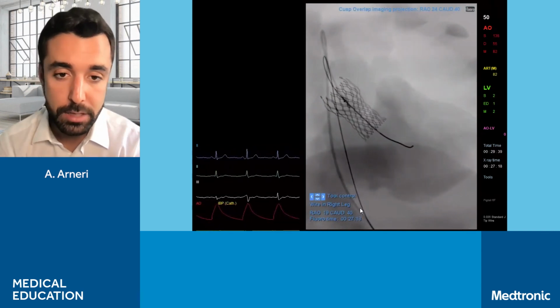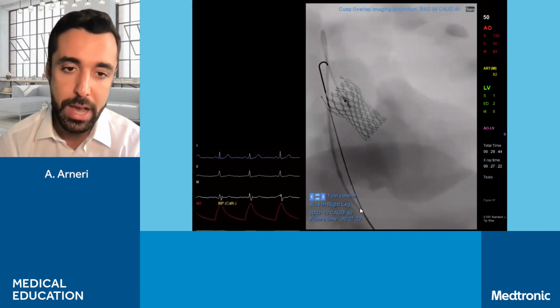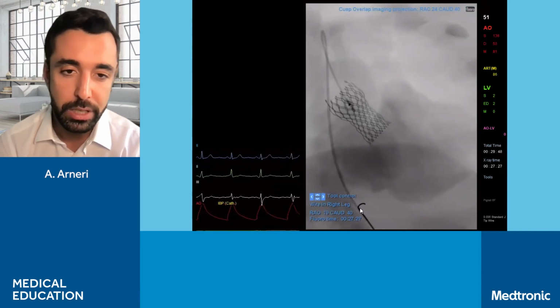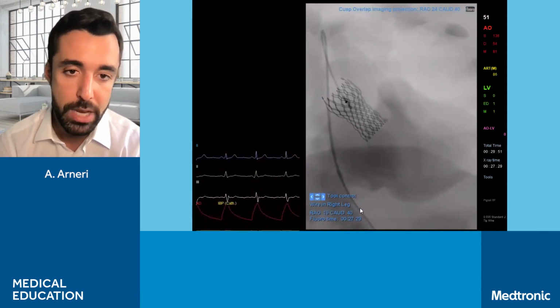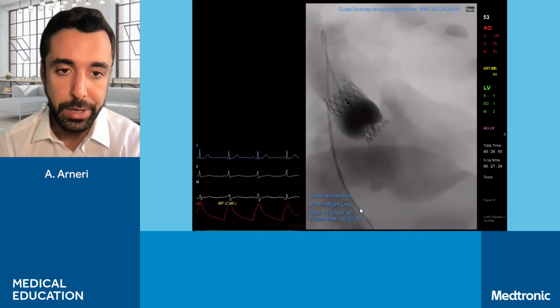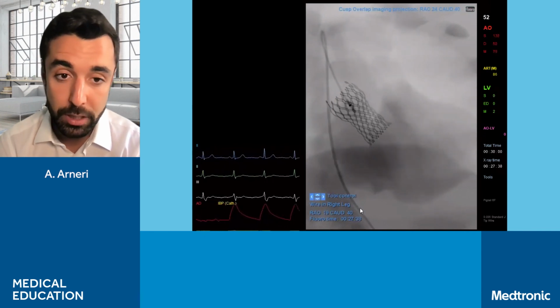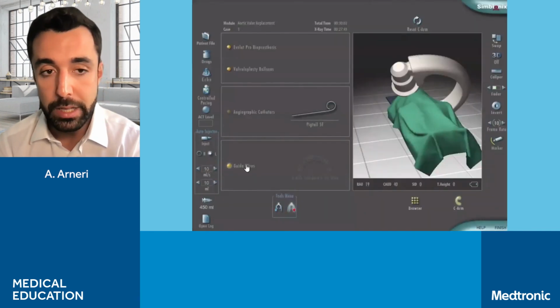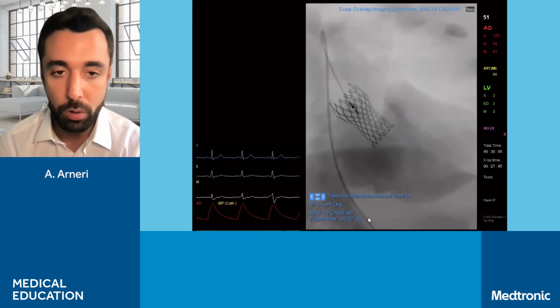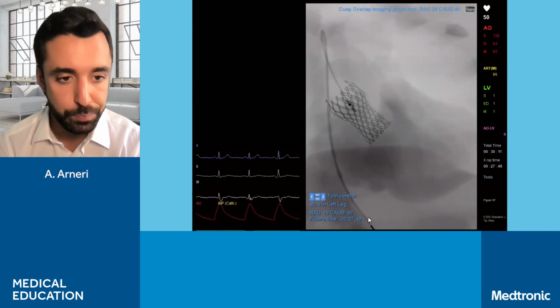And basically this is it for the procedure. Some physicians would like to do also a contrast injection now without anything in the ventricle, without the pigtail pushing over the leaflets. But if you want to save contrast, that's not really needed. At this point, you simply remove also the pigtail from the ascending aorta, and then it's only about closing your patient, the hole you have in your artery, the femoral point, etc.